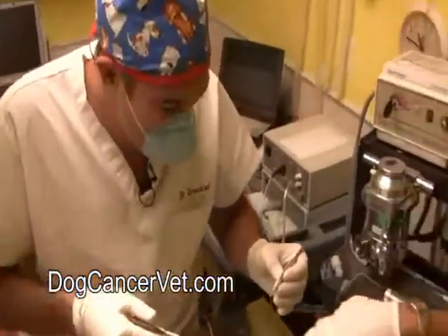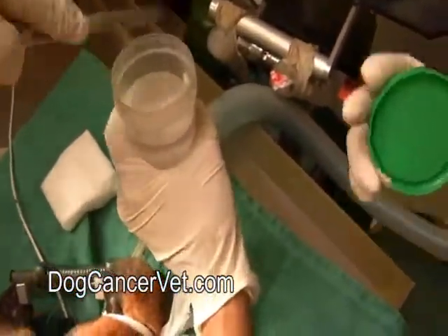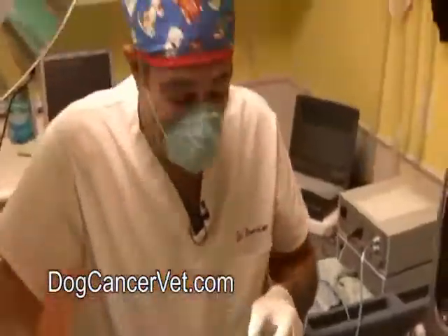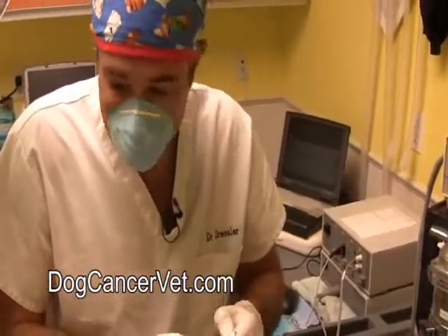It's going to go right in this formalin - this is a preservative. That way it doesn't break down when it's in the FedEx package over to the lab. Now what we're going to do is simply put a stitch in so that we can close that area up and it doesn't get infected.